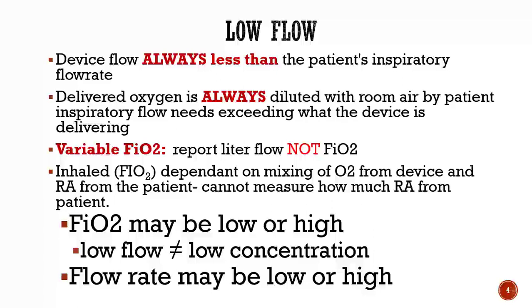Delivered oxygen is always going to be diluted by the room air that the patient is bringing in, which makes it a variable FiO2. And then again, just really not thinking that low flow means low FiO2. You can have a very high FiO2, but be on a low flow device, okay? And we'll talk about that more as we go through the devices.